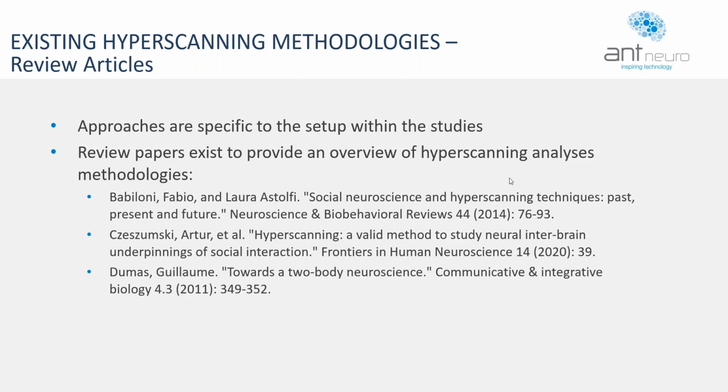Another method that they do employ when it comes to finding out more information, especially in the area of decision-making tasks, is graph theory. And graph theory basically gives you an idea about brain-to-brain links, let's say. And for those kinds of studies, graph theory is employed very much.